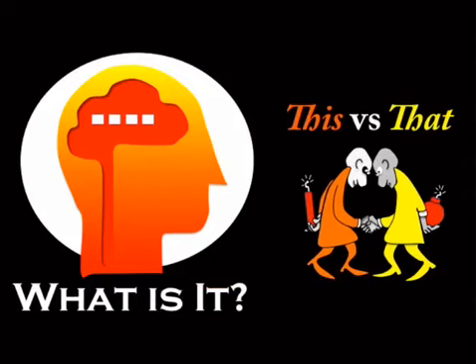All right, so let's talk. So now that I've brought up this concept of magnification, let's talk about the different types. There are two different kinds, and they are highly testable, to be made interchangeable for the purposes of confusing you. So there's geometric magnification, which is the one that you're more familiar with from prior lectures, even though I don't think I called it that, but now I'm going to. And then there's electronic mag, or the zoom.